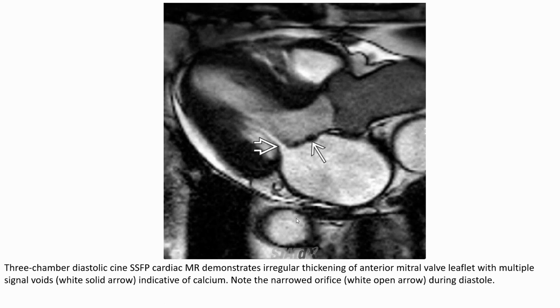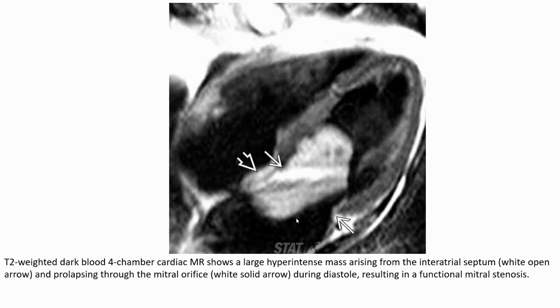This MRI image demonstrates focal thickening of the anterior mitral valve leaflet with multifocal areas indicated by the white solid arrow, indicative of calcification. Note the narrowing of the orifice during diastole, indicated by the white open arrow. These MRI images show a large hyperintense mass arising from the inter-atrial septum prolapsing through the mitral orifice during diastole, resulting in extrinsic functional mitral valve stenosis.